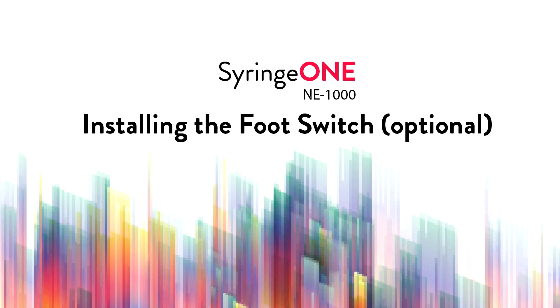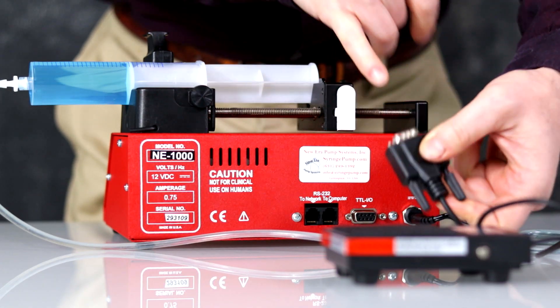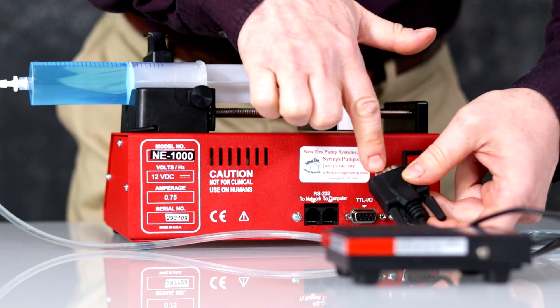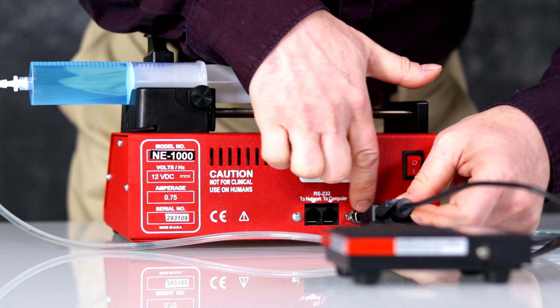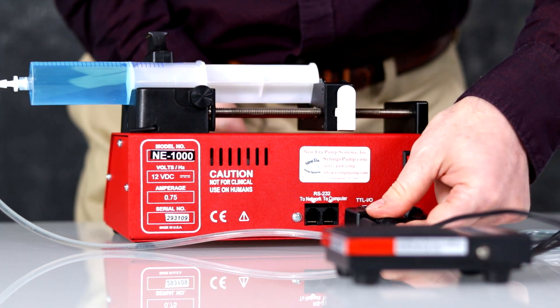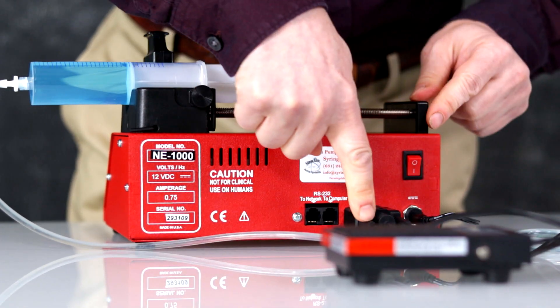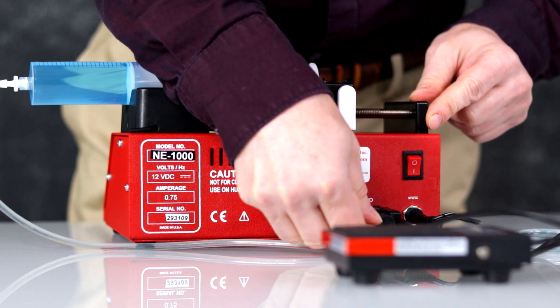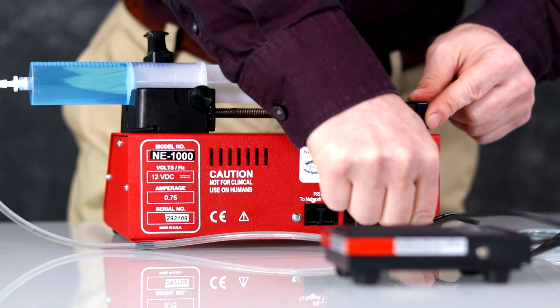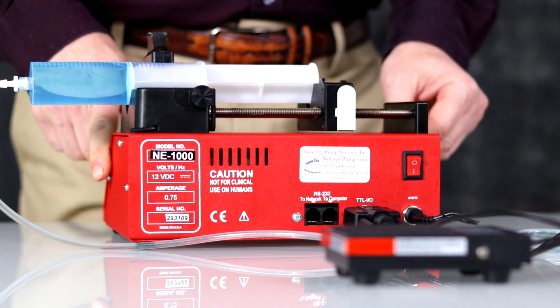Installing the foot switch: make sure that the foot switch connector is lined up. Ensure that the long edge of the top is lined up at the long edge of the connection. Insert into the back of the pump and tighten with the two thumb screws. By default, the pump is configured for foot switch mode. The foot switch is ready to go.